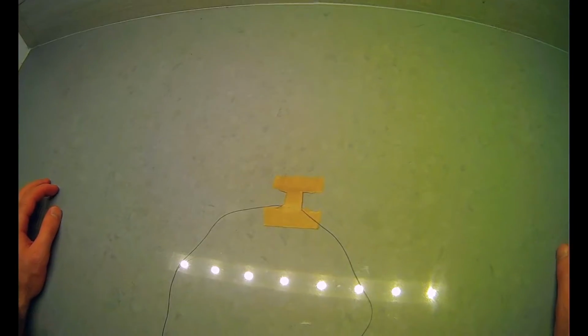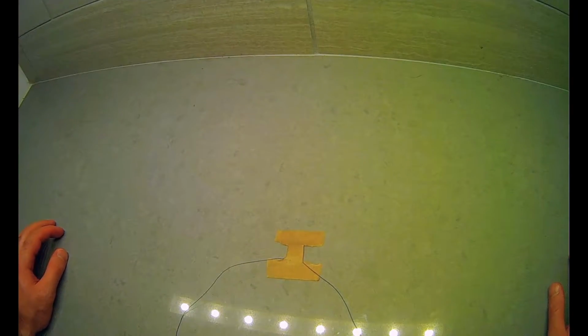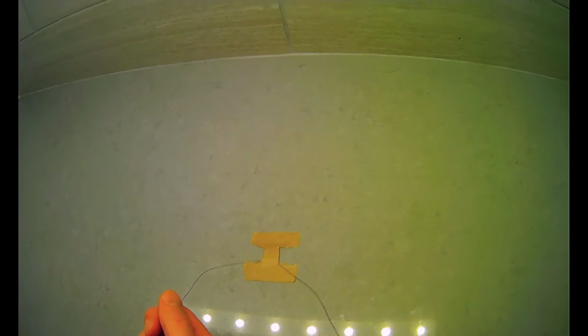Now, just to start, we're going to do two-handed knots. And I'm going to show you both. There's two orientations of throwing the knot, and we have to do them individually first just so we can learn them and we don't get overwhelmed, but in the end we'll combine them together. And this is so we can throw square knots just like we did with our instrument tie. So just like when we were instrument tying and we're pulling in opposite directions, because we don't have an instrument when we have our hand, we just have to change the positioning, and then we can throw square knots with our hands without issue.